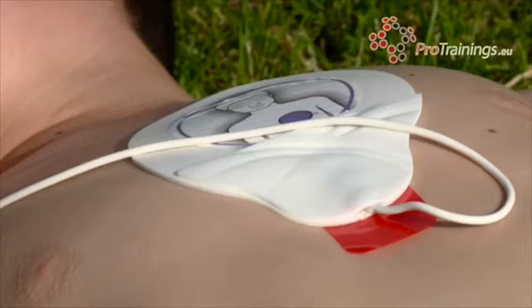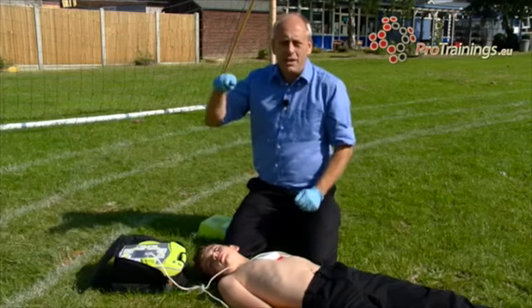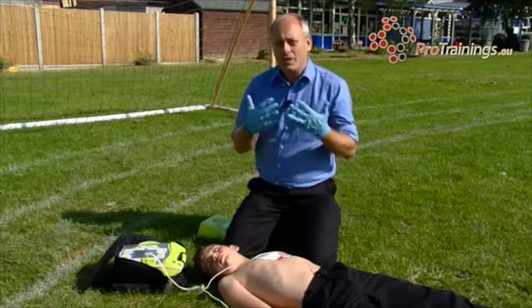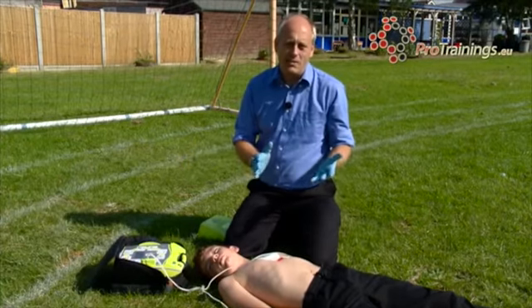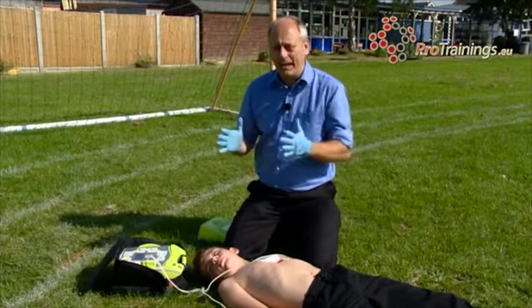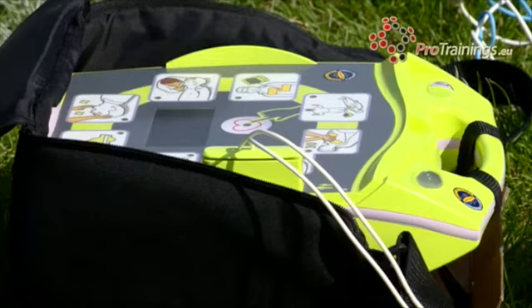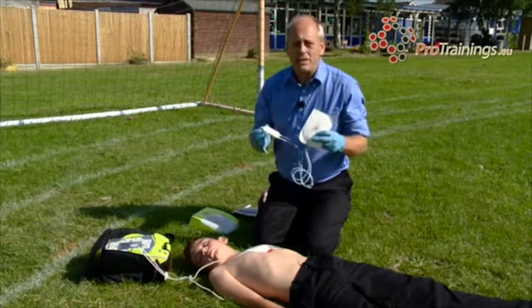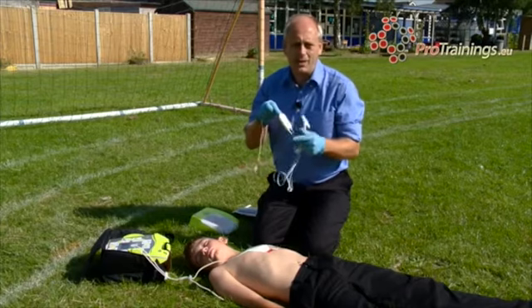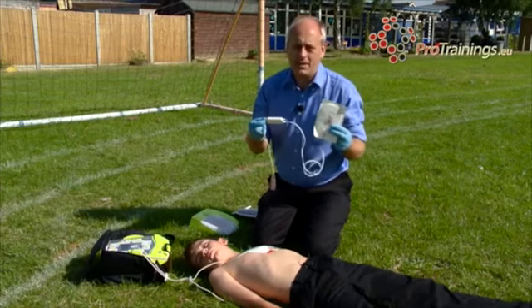The next thing we need to do is to activate the unit. Plug in the cable, stay calm. So in this scenario, pads are on, the plug's gone in, it's said that the pediatric pads have been added, so we know that we're dealing with the pediatric pads rather than adult pads. What's happening inside the unit with this one is it's changing to a pediatric algorithm rather than an adult algorithm. Other brands of defibrillator and pads may well have a resistor through. So what's happening here is the actual pads themselves put it into pediatric mode.